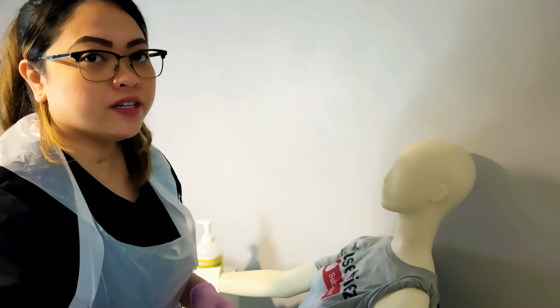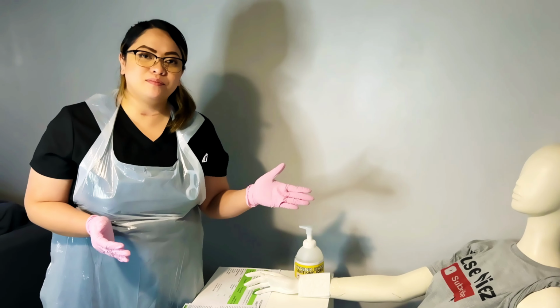And let it dry for 30 seconds. Wait, then into the clinical waste bin. Since I'm using a hard mannequin, I'm going to use a sponge for you to see how it's done, okay? Imagine that this is the patient's arm, alright?